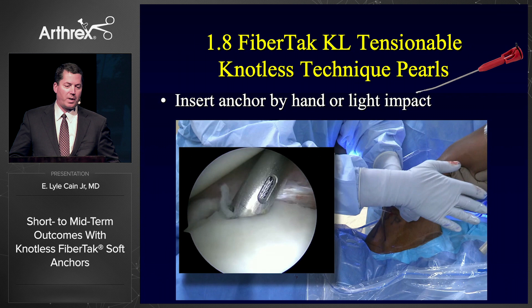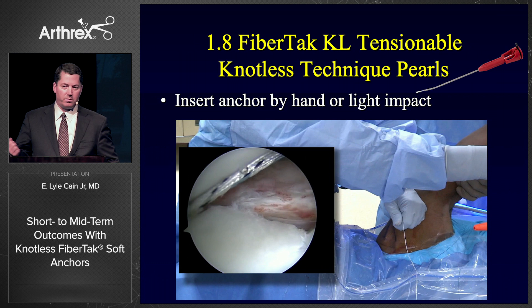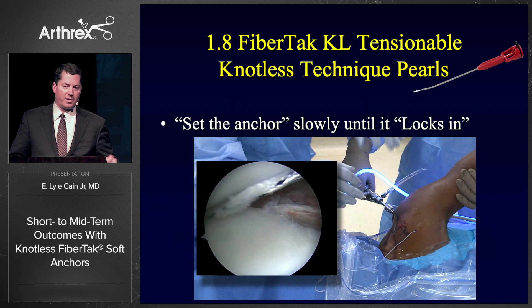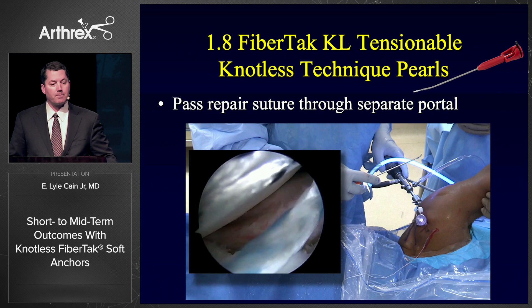You don't move the guide because it's such a small hole — if you move just a millimeter, you're trying to put a 1.8 anchor in a 1.8 hole and you'll miss. I like to insert these by hand; I think it makes a huge difference. I just tap it a couple of times on the back of my hand — not very hard — and if you're in the right spot, this anchor goes in very easily without much force. You don't have to knock it with a mallet. Setting the anchor is really important: pull back and it moves about two or three millimeters and then stops. I compare it to setting the hook on a fish — pull slowly, then yank it and it's not going anywhere.